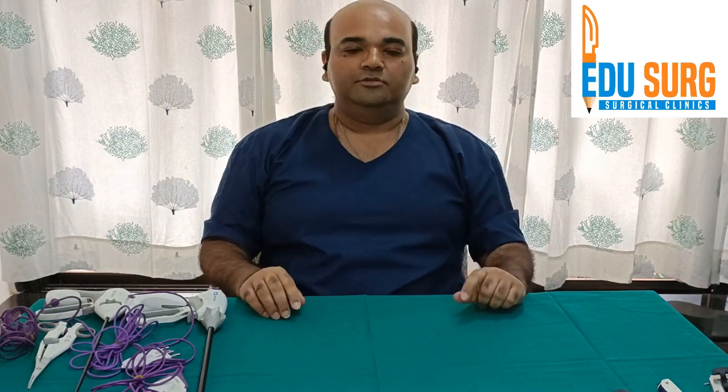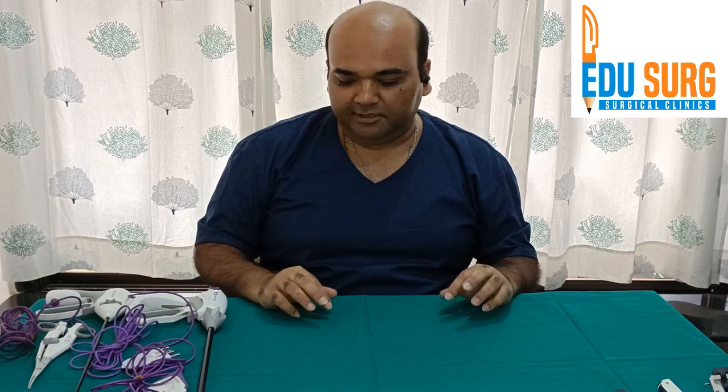Hello everyone and welcome to EduSurg Clinics, where we discuss key topics related to common medical and surgical practice. I am Dr. Dunjan Besai, and today we are going to discuss some energy sources commonly used in laparoscopic surgery practically.